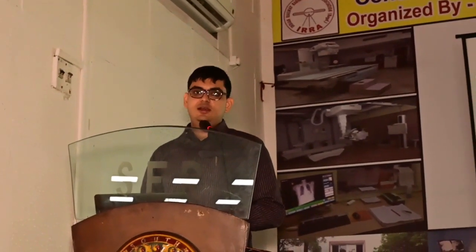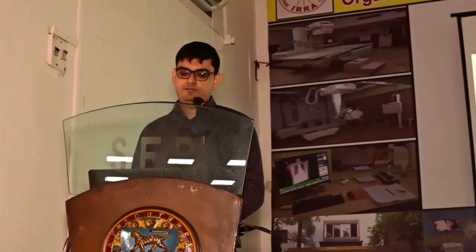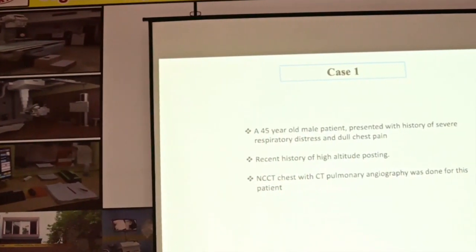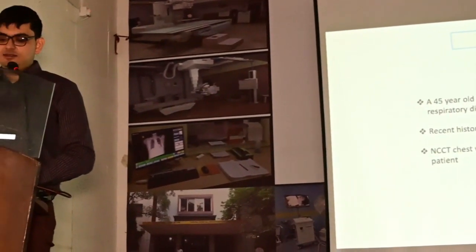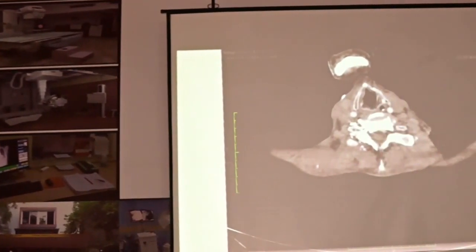So my first case, this was a 45-year-old male patient. He presented in emergency with severe respiratory distress and dull aching chest pain. He had a recent history of high altitude posting. So ultimately, after proper clinical examination, NCCT chest with CT pulmonary angiography was done for this patient. So I will be displaying some cine loops.